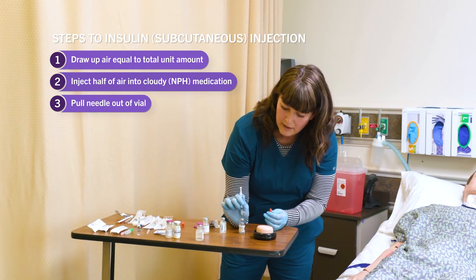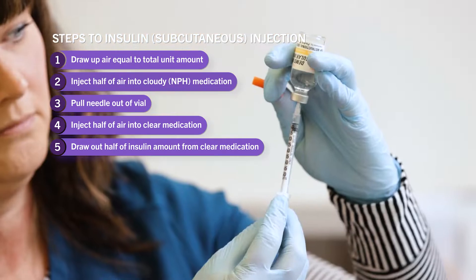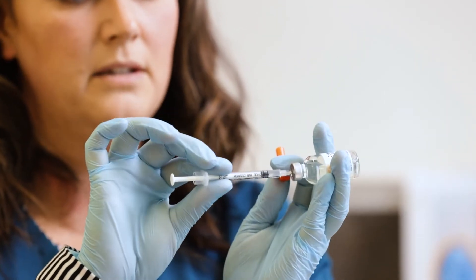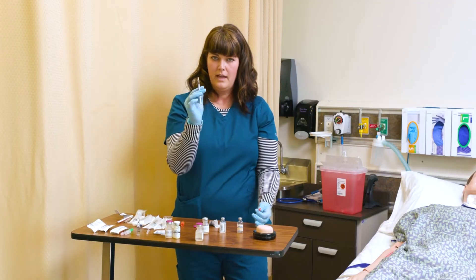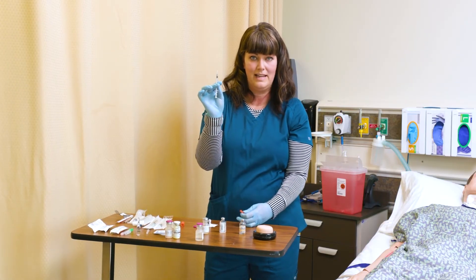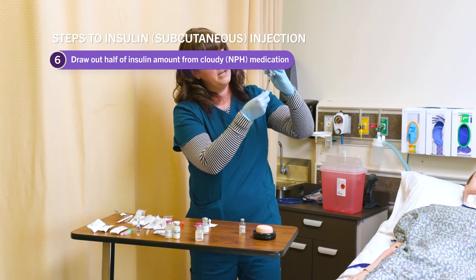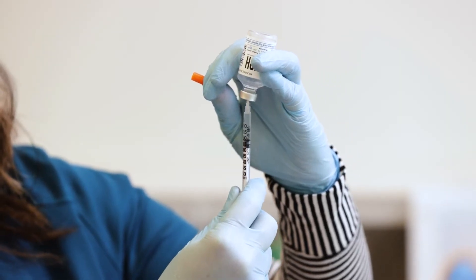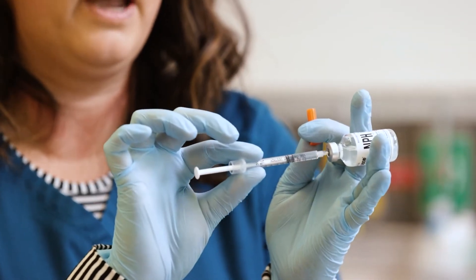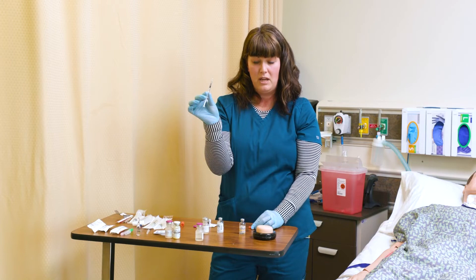Now I access my regular vial, push in my 10 units of air, and draw back 10 units of insulin. I pull out of that vial — I've already put my air in, and that's why we do it this way, because I can't inject air at this point with insulin already in the syringe. Now I access the NPH and draw out very slowly. We don't want to push much back in because we don't want to push regular insulin into that vial. Now I've got my 20 units of mixed regular and NPH insulin.